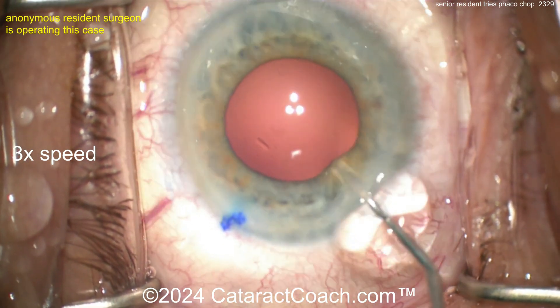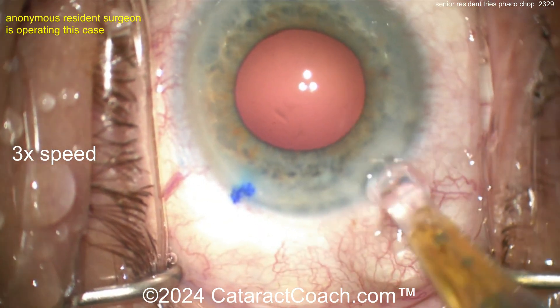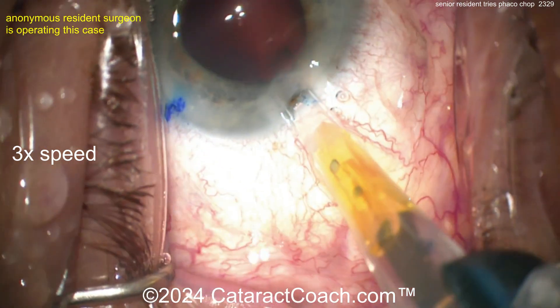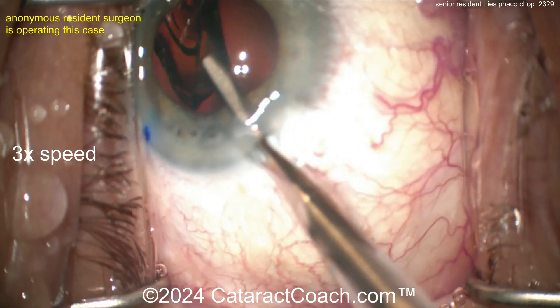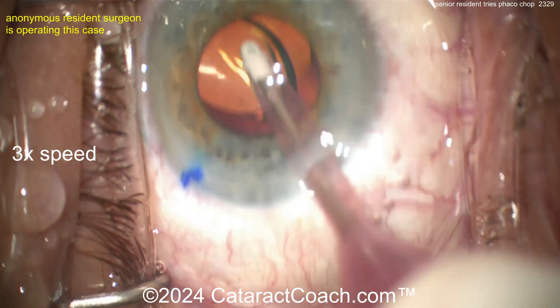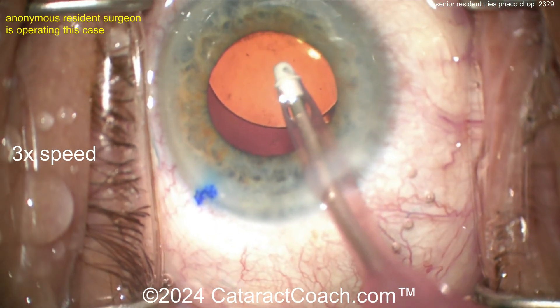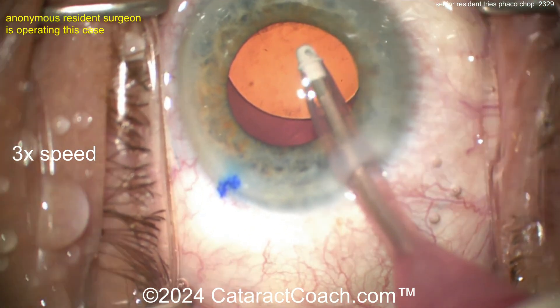Here comes the cohesive viscoelastic. Now the lens — a single-piece acrylic lens going inside the eye. Get it delivered, keep the eye in primary position. Once it starts to inject, pull your hand down, get the eye back in primary. Get that lens into the capsular bag — using the probe to position it. You've done at least 200 cases — fantastic, great job.